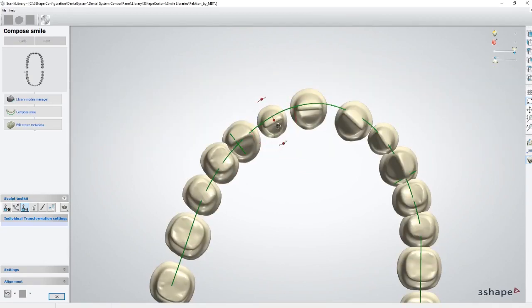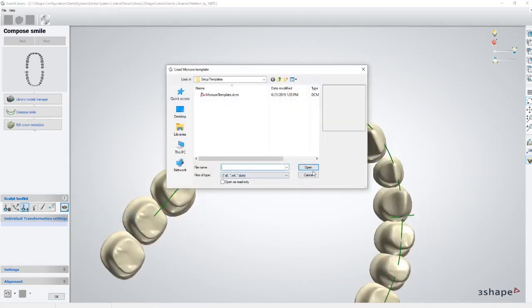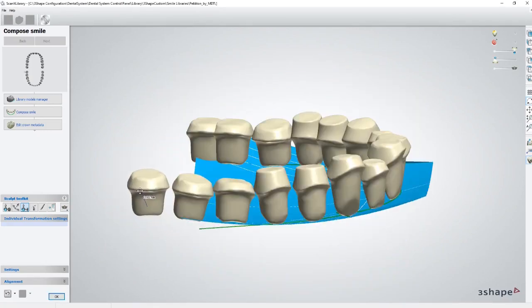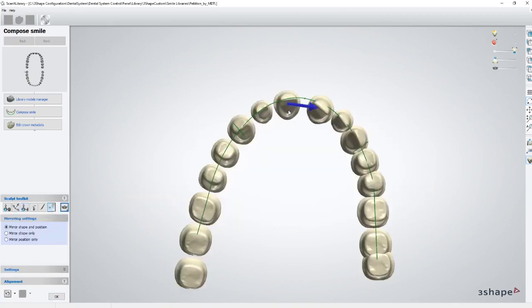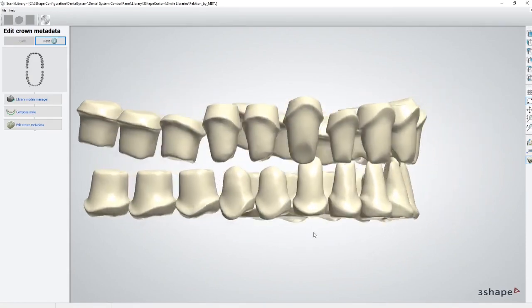Sometimes it's also helpful to import the Monson plane. It's imported by 3Shape. So you can adjust the curve of Spee and curve of Wilson properly. I do only one side because the other side I can mirror really easily with the mirror shape and position tool, just by clicking on each tooth and they jump right over. So I did the lower here. Lower and upper arch are done.